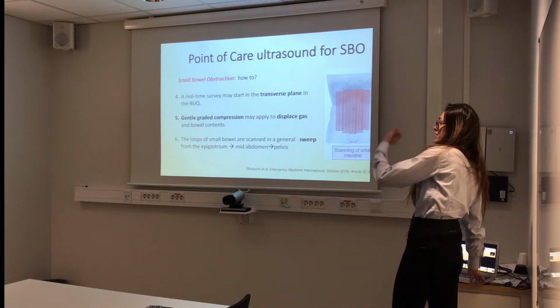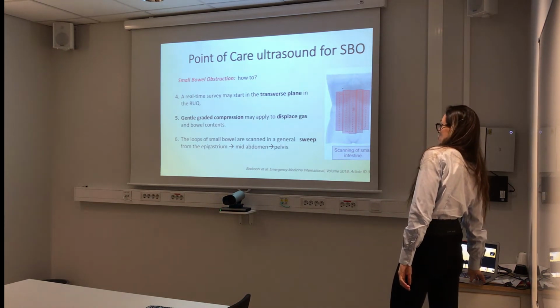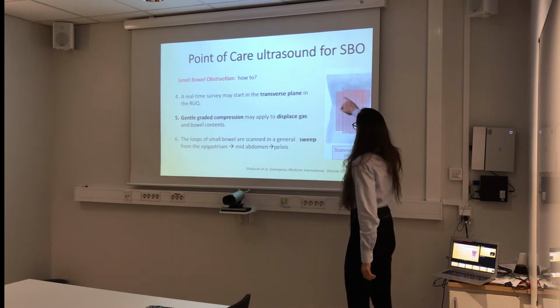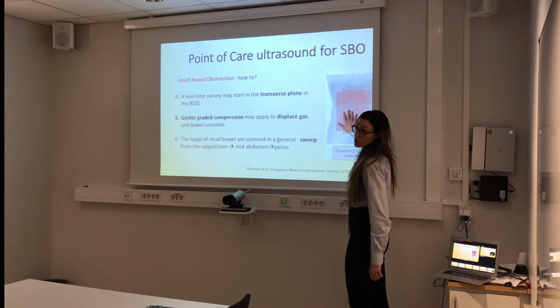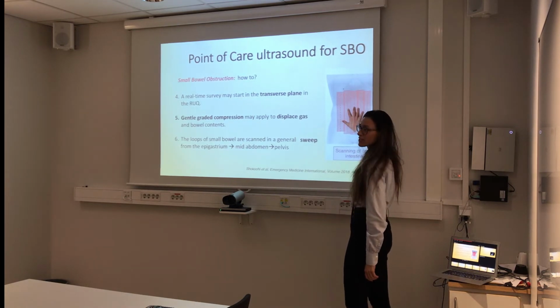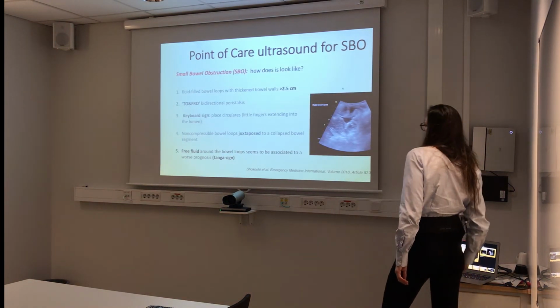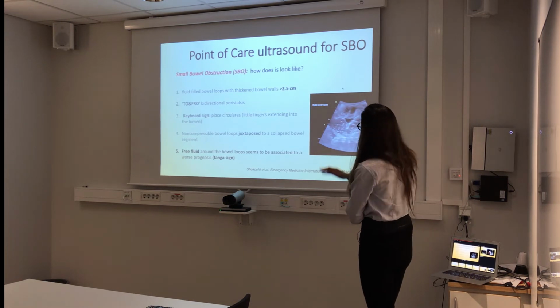Okay, so with gentle graded compression, always try to displace the bowel, and this is basically what is suggested. Of course, we will focus more in this area because this is the transverse colon, so you cannot see very well; it lies more in this area. We can do it together if you get a patient. So, small bowel obstruction, fluid-filled bowels.